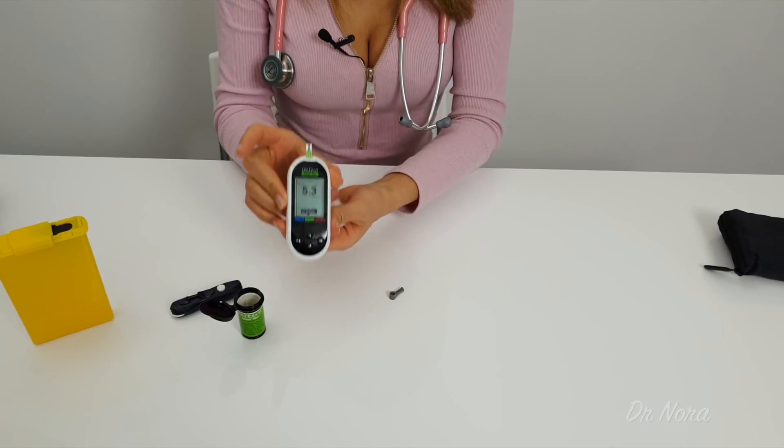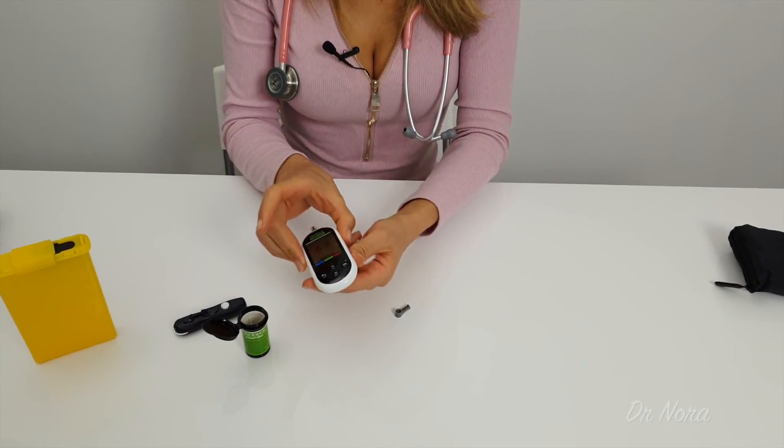It's really important to write down that number. Some of the testing devices will be able to memorise those numbers for you and you'll be able to put them onto your computer. But to show your doctor or your diabetes educator, make sure you take a note of it.